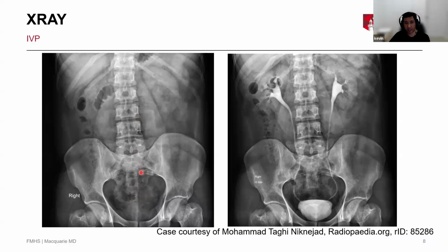However, when you inject contrast and the kidneys excrete it, you can start seeing that it opacifies the inside of the collecting system. So this is the urine with contrast in it, okay? And you can see very well, they've obviously selected this from multiple images, because I guarantee when I used to look at these, they never looked that beautiful.